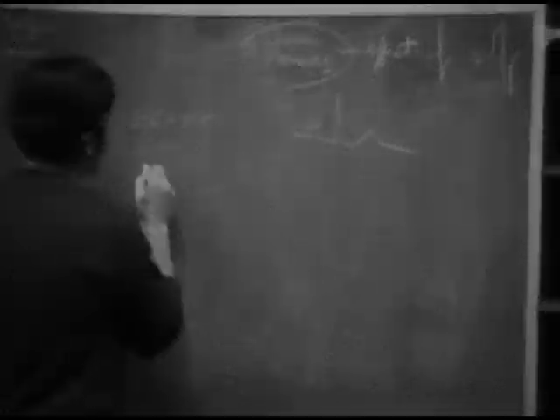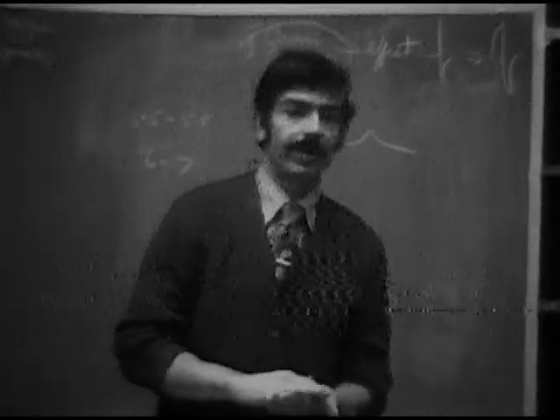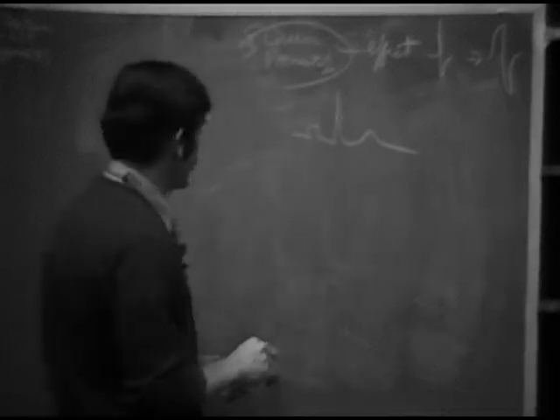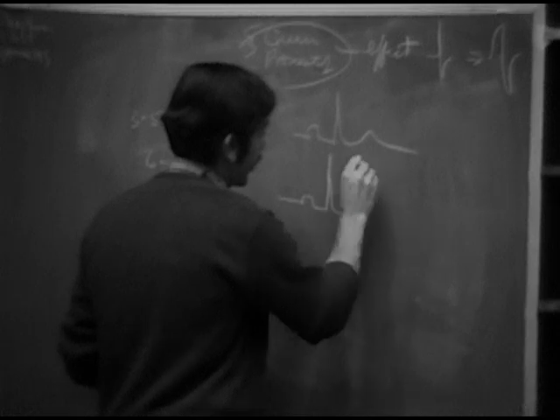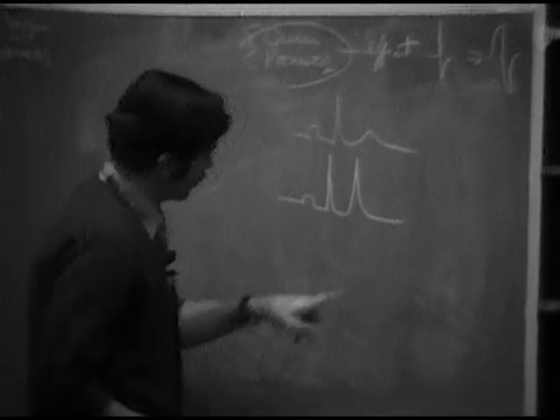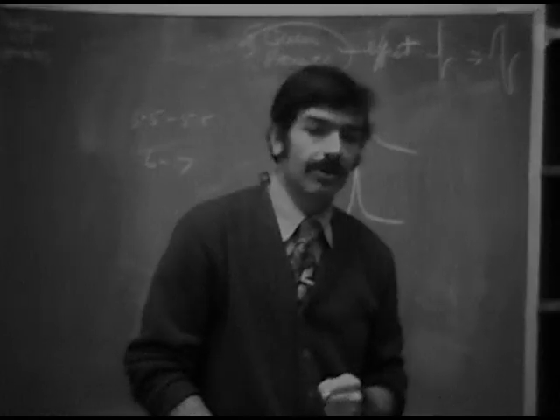Now when the potassium goes above 6, in the range of 6 to 7, what is the first thing that you see in the electrocardiogram that reflects hyperkalemia? Right, you get T wave peaking. You get an appearance that looks something like this. A little exaggerated, but sometimes they do look like that. You get tenting of the T wave. So this is a relatively early sign of hyperkalemia on the electrocardiogram.